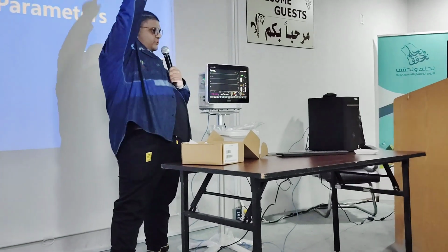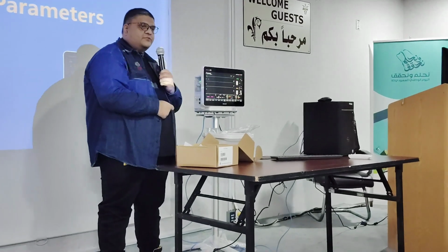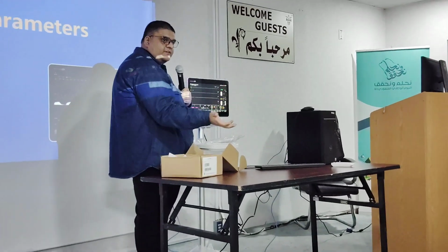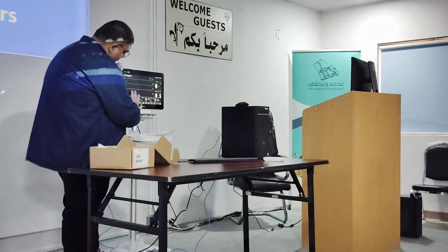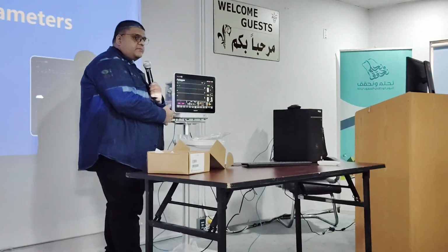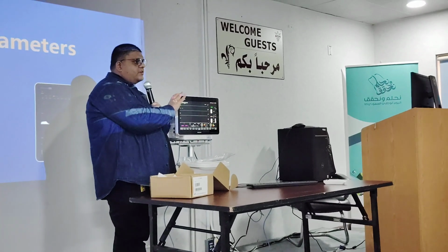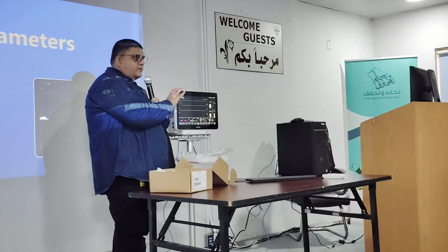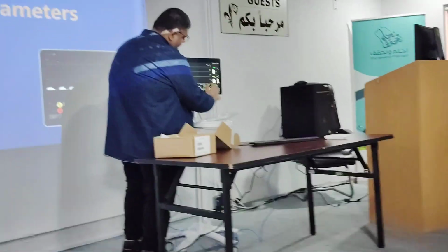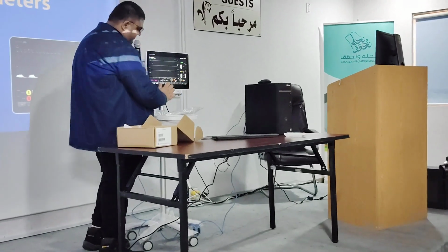In your Android, you have to pull down the tab and slide it, right? Even your Android cannot do what our monitor does. Our monitor is more advanced than Android. Agree? Okay. Like that, there we go. Actually, this monitor system is Android based. It's not Android exactly, it's Linux, but it is kind of similar. Alright, so here's the volume, that's the minimum.